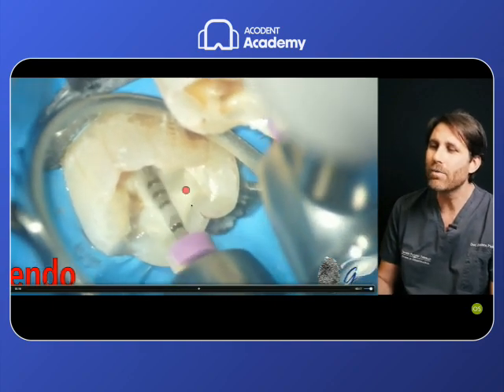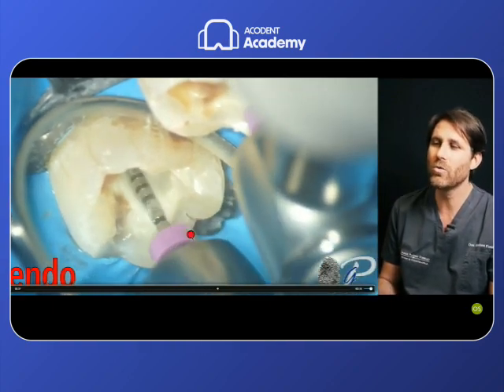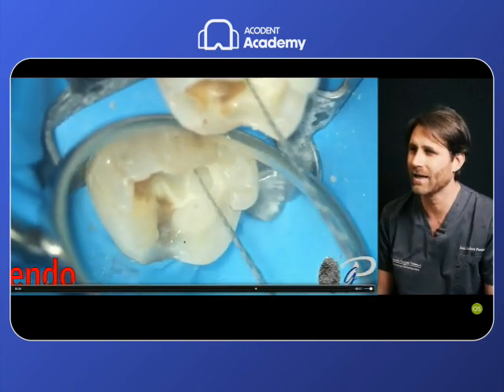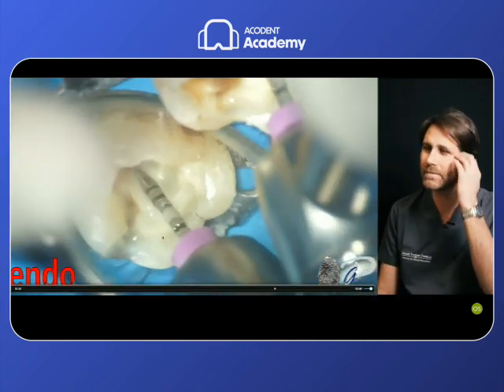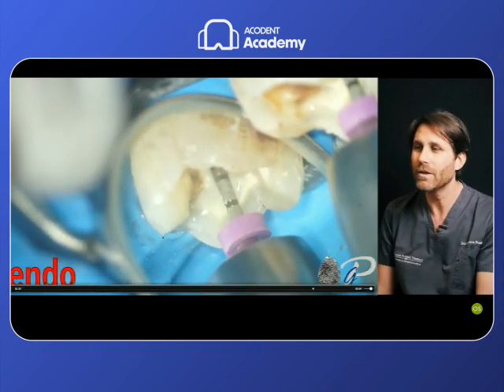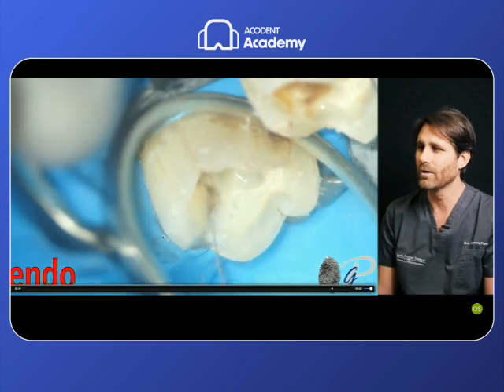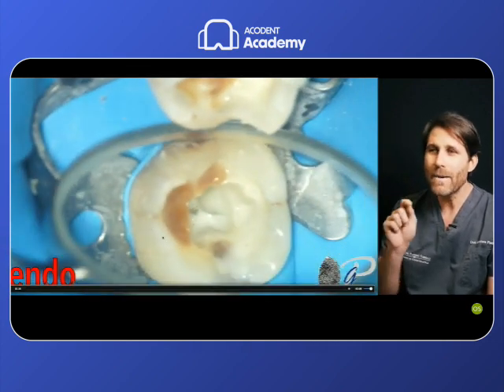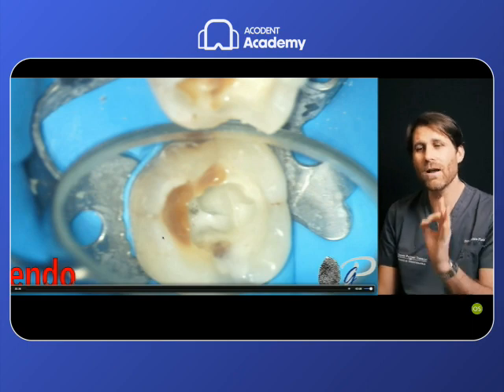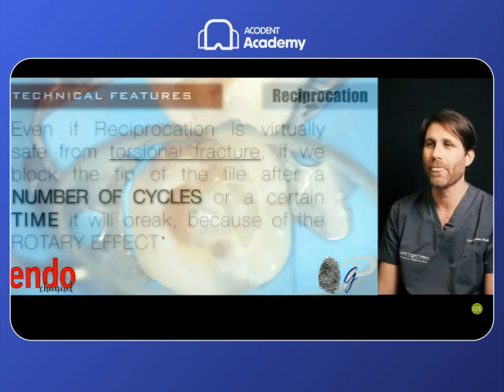And look, it's proceeding very slowly towards the working length, gaining those 2 millimeters that I was missing in the clinical case. And look at the shape of the tip. It was having the shape of this particularly difficult apical root canal. And this is the technique: up and down, short, fast movement in a delicate way, just pushing a bit on the tip, and go away for 4 or 5 times.